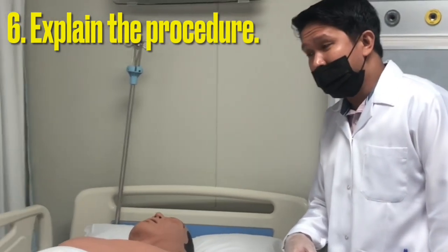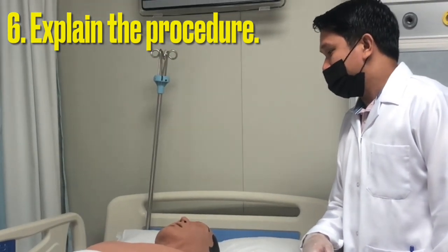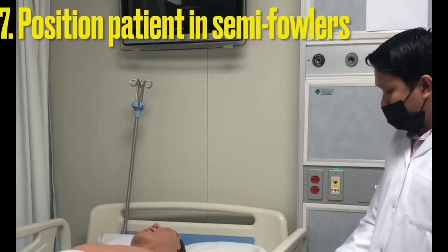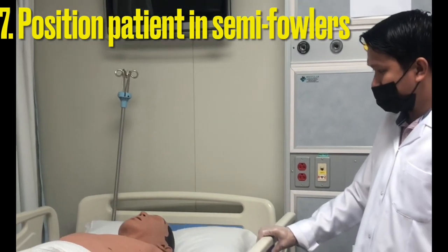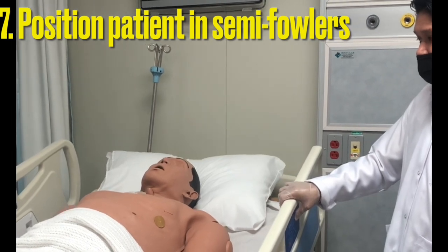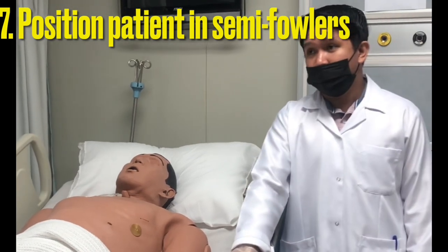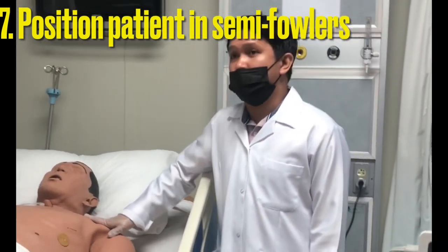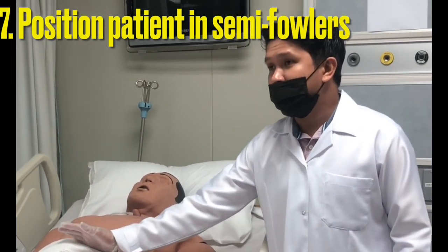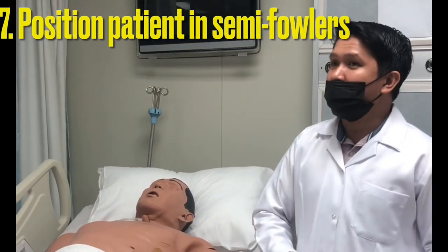Step number six is to explain the procedure to the patient: 'Hi, my name is Mark. I am your nurse for this shift and I'm going to administer oxygen inhalation for you. Would that be fine with you?' Then step number seven is to put the patient in semi-Fowler's position — about 30 to 60 degrees. This position promotes comfort and makes the patient breathe effectively so that the diaphragm can move downwards without difficulty.